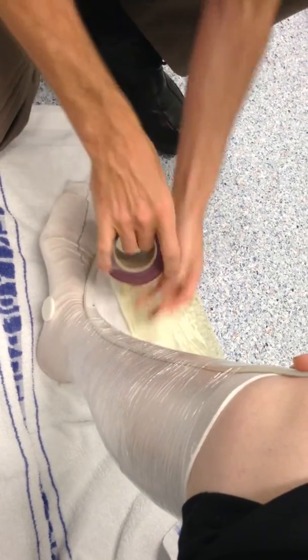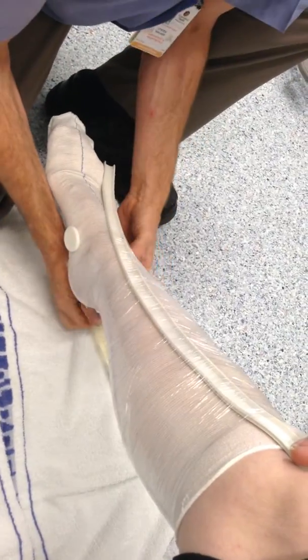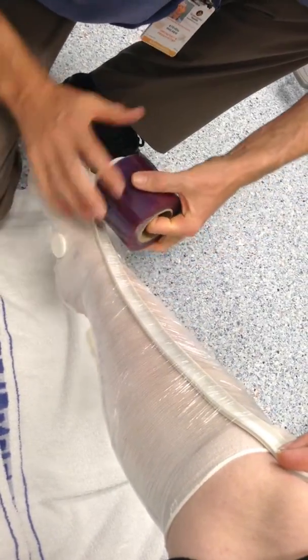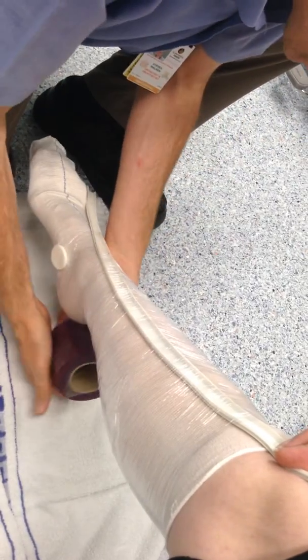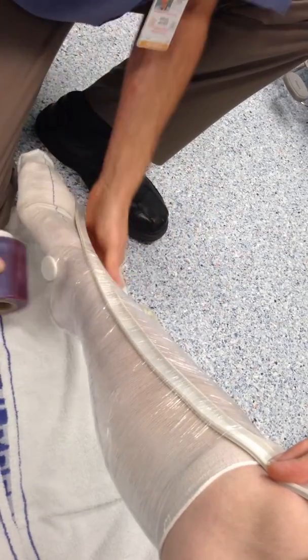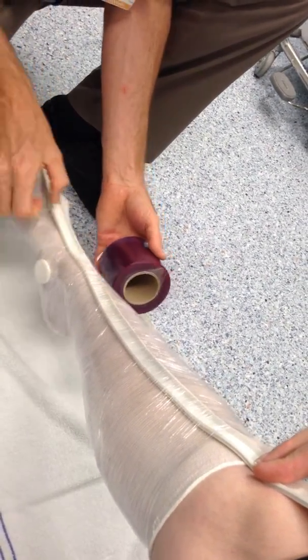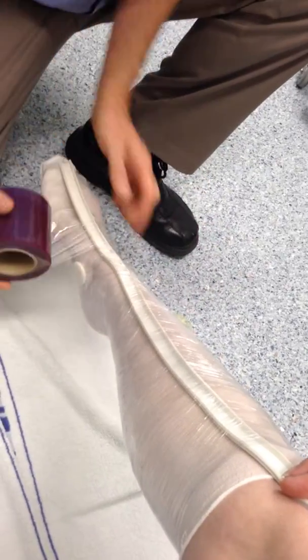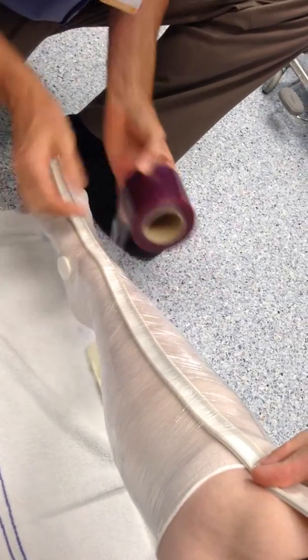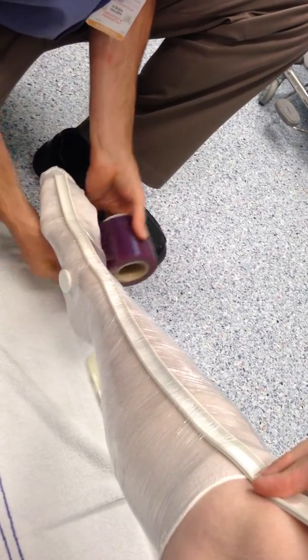Can I get you to lift your foot there? The whole leg. Is that okay? I'm just going to rub that. This kind of stuff is interesting when you're sitting down watching something — like, how do they do that? How do they make those? Exactly — it's the process of doing that. Well, this is educational. Definitely. Oh, it's interesting as well.